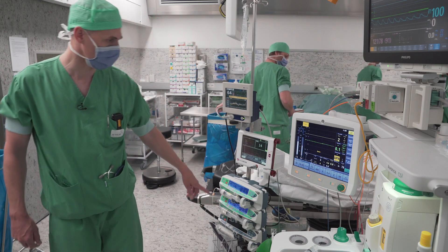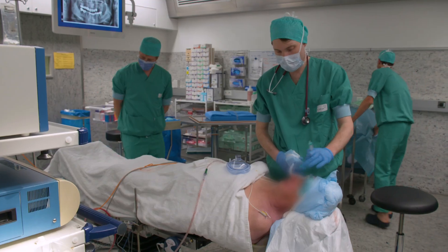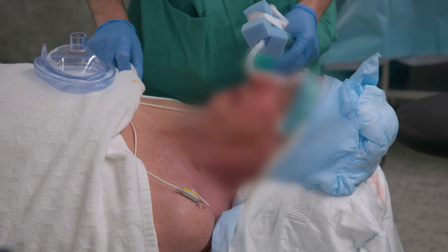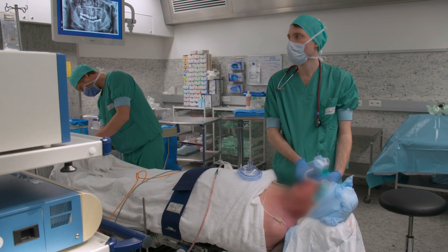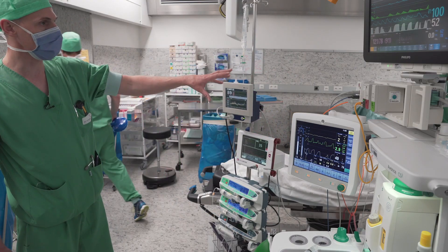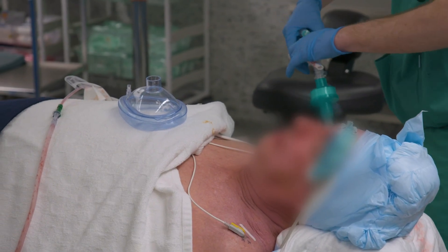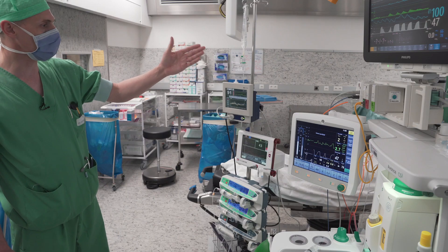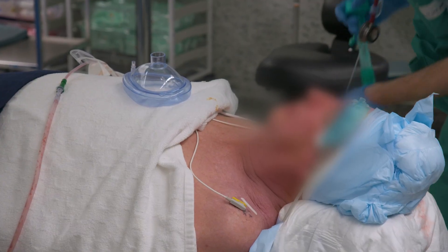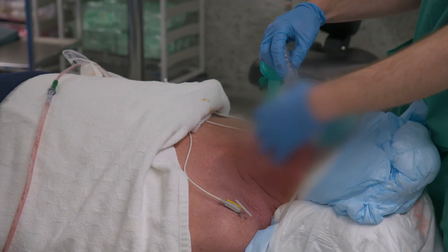We are waiting for the remifentanil to decrease and for the CO2 of the patient to increase — this balance will eventually lead to starting to breathe. There's now spontaneous respiration starting. I think now is a good time to extubate the patient because there is some responsiveness on the BIS. The patient is still a bit sleepy and in a sedated state, but there's some response to name calling. You see the smoothness of the extubation — the patient doesn't cough, there's no real stress. You see some increase in the NOL, but it's not going through the roof. This is a very gentle extubation.